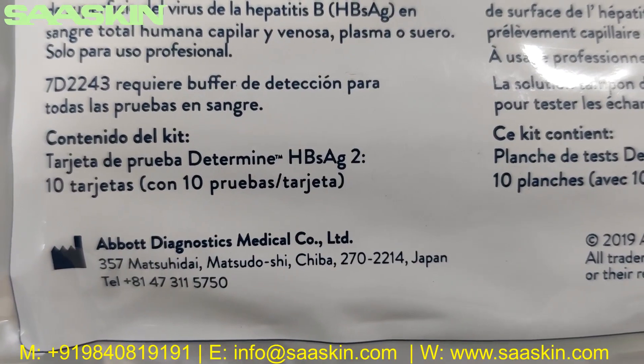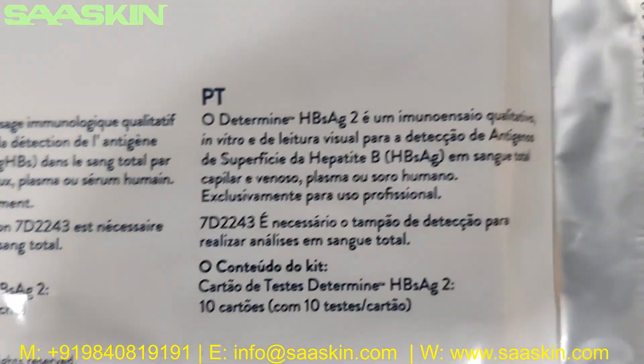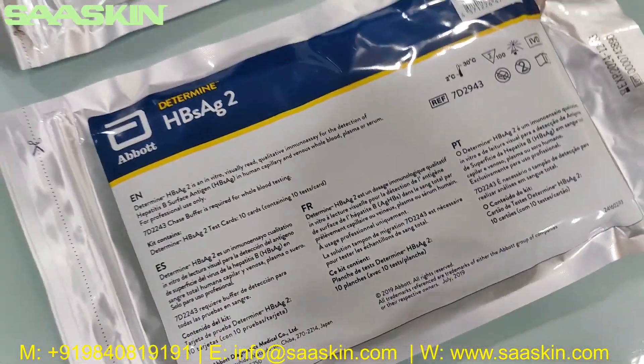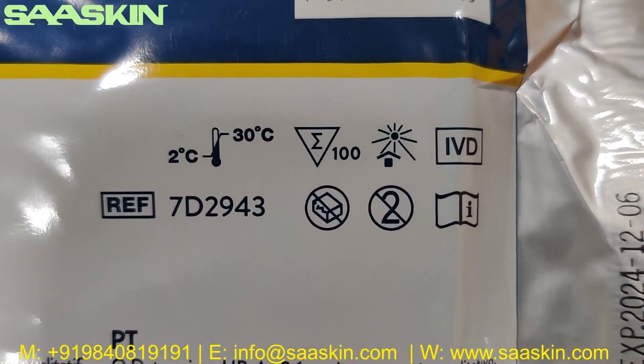This is manufactured by Abbott Diagnostics from Japan. You can see the expiry period is written on this side. It can be stored at normal temperature.